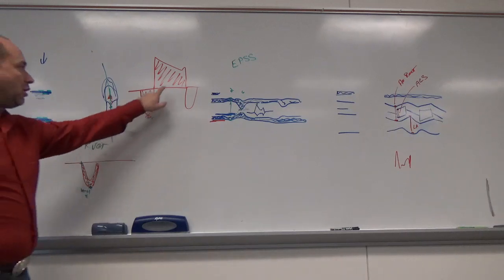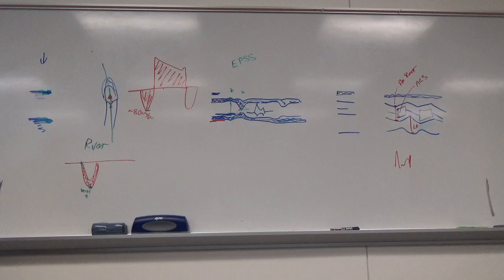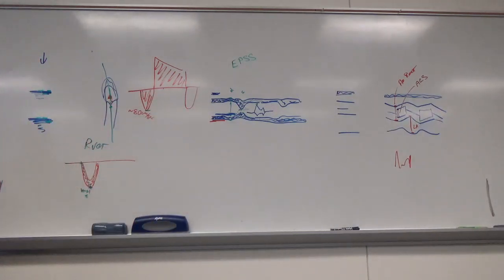On the pulmonary, we do get a little bit of a kick at the end. For whatever reason we get that, and it's just characteristic of it. Aortic valve is going to look the same except without that. Okay, so we do both PW and CW on this. On pulmonary valve, yes. Good.